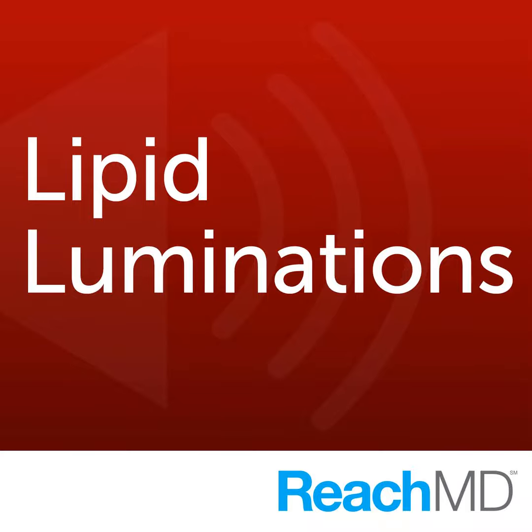Yeah, absolutely. And then again, with regard to reproducibility, currently, a big source of controversy is whether you should remeasure carotid IMT. Currently, the appropriateness criteria said no to that, but there is a writing group that's going to be forming here to talk about remeasuring carotid IMT. And I think in the long term, as ultrasound technology continues to improve and the technique for measuring the exact same area of the carotid in the same patient becomes more advanced, repeat measures of carotid IMT will become part of the forefront. But today, on May 20th, 2011, perhaps not.